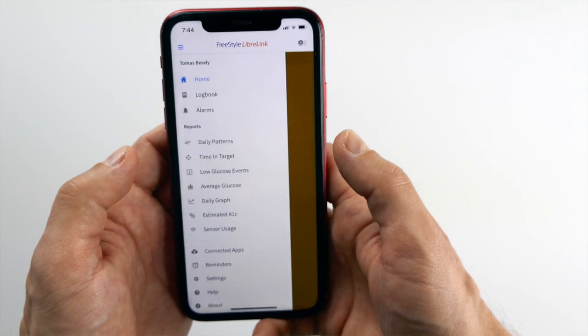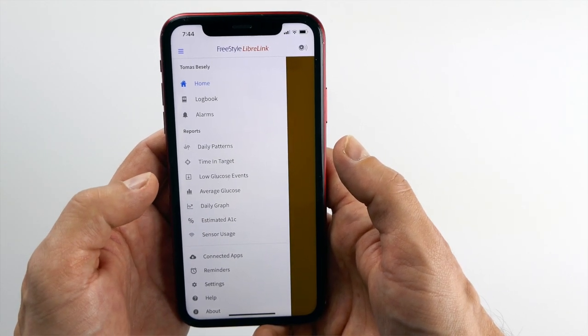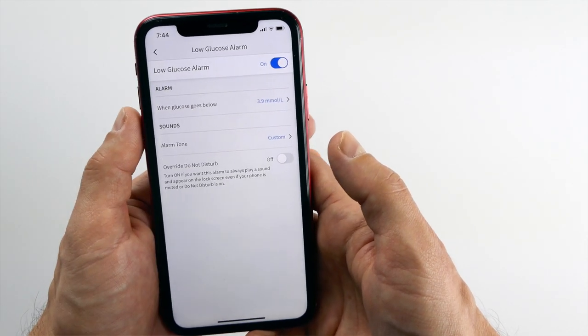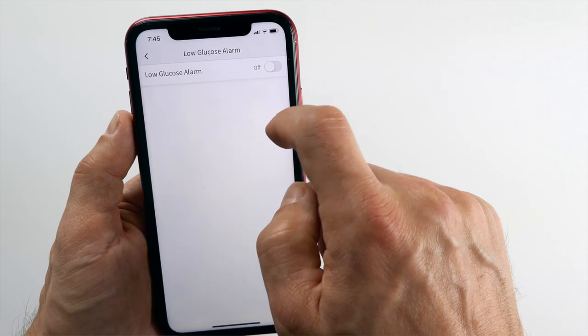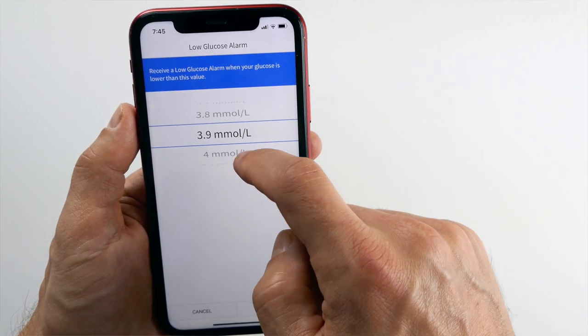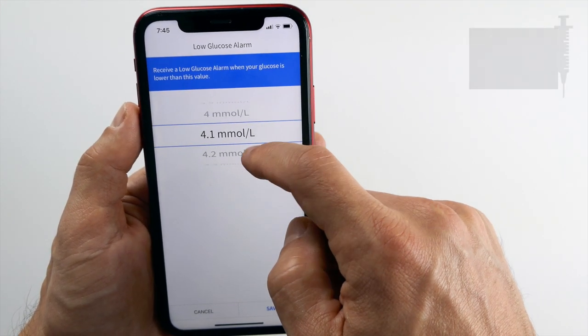Step 4: how to set the alarms — I'm going to show you how to do it on the phone first. It's very simple. You open the LibreLink app and in the menu on the left-hand side you select Alarms, which will bring you to the alarm settings screen. First we set the low glucose alarms. By default they are at 3.9 millimole, but you can have them anywhere between 3.3 and 5.6. I like to have them at 4.5 because that's approximately the moment when I'm dropping where I want to get a snack or suspend my basal rate on the insulin pump to prevent a hypo.